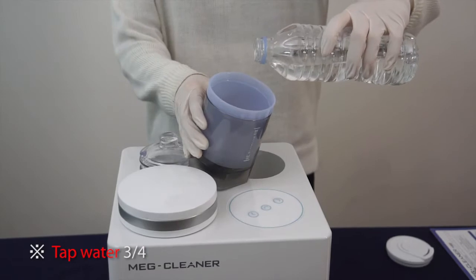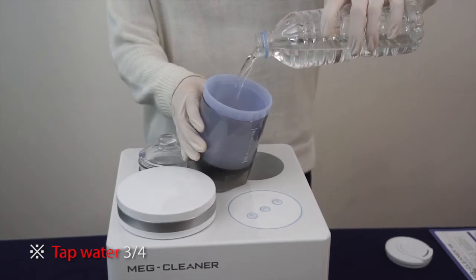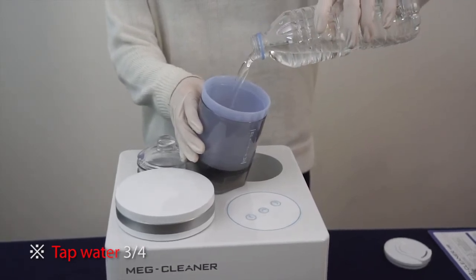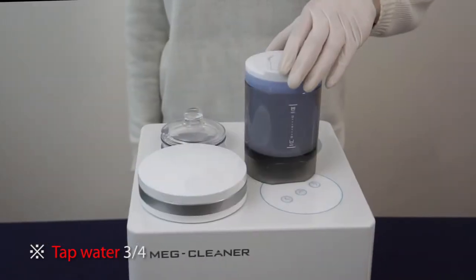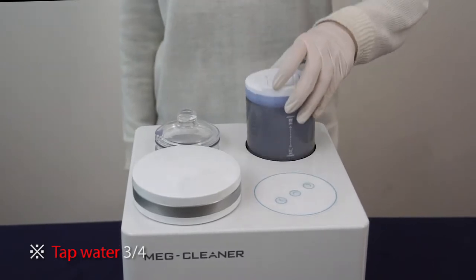Fill the tap water into the rinsing jar up to the three-fourths level. If using purified water, there is no pasteurizing effect because enough underwater plasma can't be created due to lack of minerals in the water.